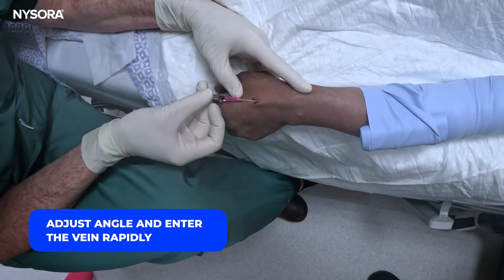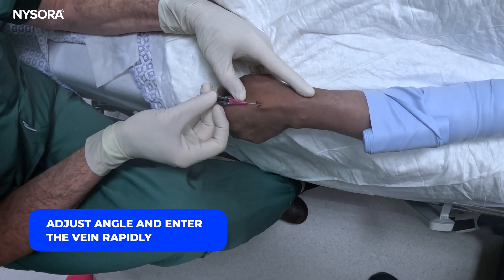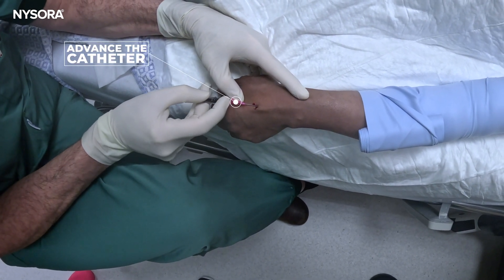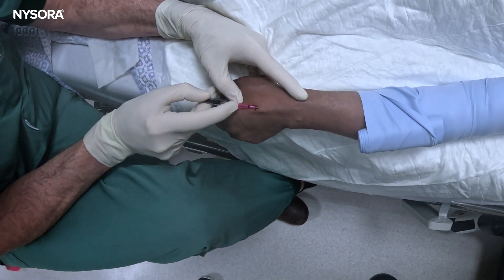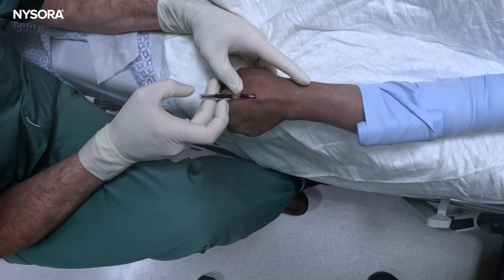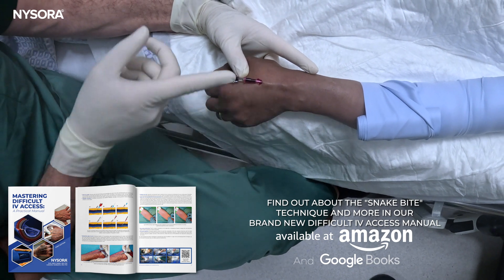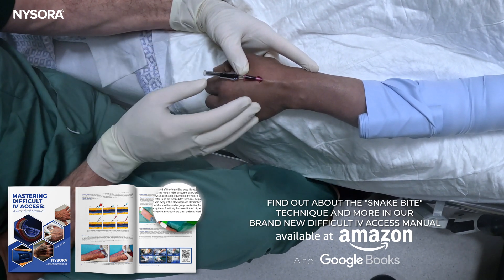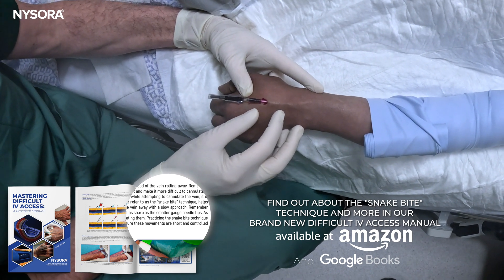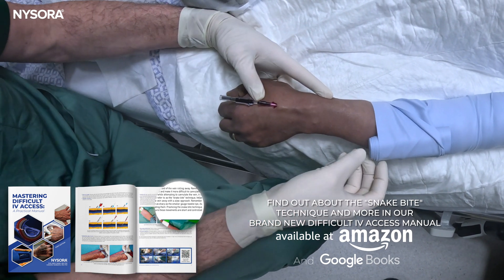There you go — inside the vein. You saw there was a very sharp, quick maneuver. I'll place it another millimeter deeper and then start advancing the catheter. There it is — that's successful! So that was a paravinus insertion with a slight re-angulation after administering local anesthetic, and a very brisk quick maneuver in a patient with nearly impossible veins.